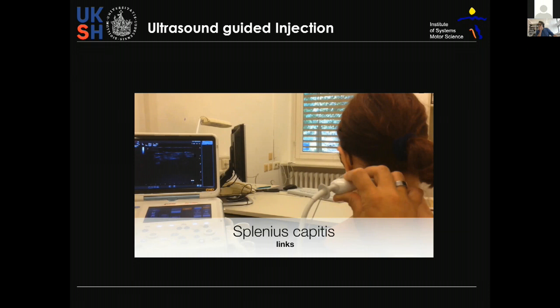Okay, thank you. So then the next question is, how about ultrasound in anterocollis? Okay, I skipped this because, yeah, so what I do in anterocollis, I typically treat the sternocleidomastoideus and the scalenus anterior. I do not show the sternocleido because it's obvious this is a very superficial muscle. The only thing you have to know is do not inject deeper than the muscle is. And I think this is the most common mistake, that maybe an injection of about 1 centimeter is too deep. But I inject the sternocleidomastoideus and I inject the scalenus anterior, typically as the first 2 muscles. If this does not help, I go for deeper muscles, which is the longus capitis and longus colli.